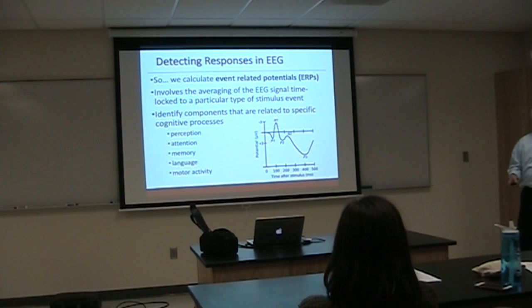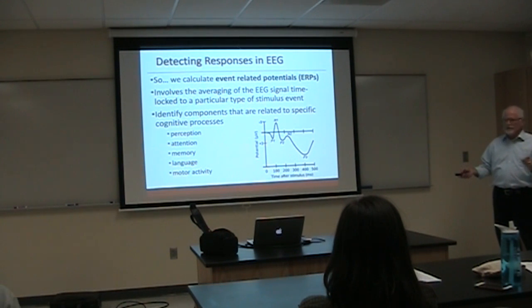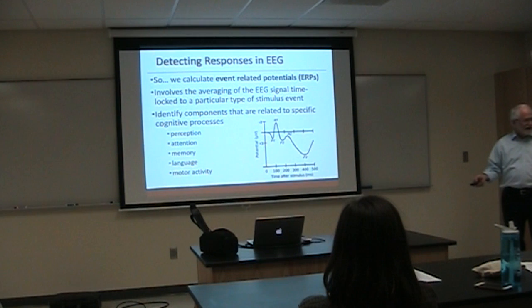And due to a historical quirk, often the ERP plot is upside down compared to what you would expect, so that many researchers plot positive deflections going down. So notice it's really important to look at the scale on the vertical axis of an ERP plot, because frequently you will find that the positive side is down and that something that looks like a positive spike is actually a negative deflection. Got that?